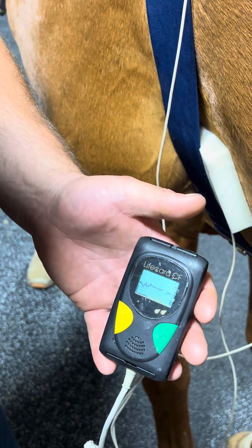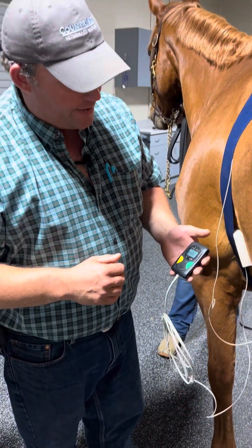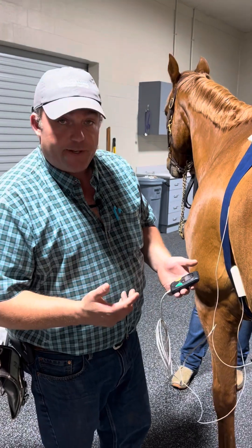This device can actually record for up to seven days. So once we know we've got a good waveform on our ECG, we'll get him fitted up for the monitor and get him back comfortably installed.